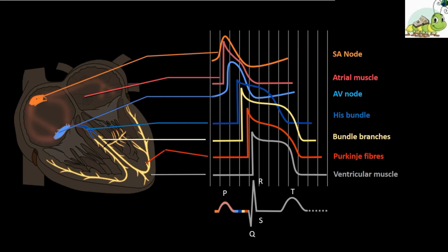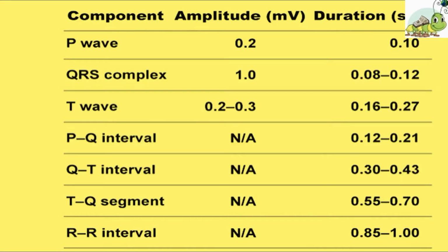Number 3, the T wave, an upward deflection associated with ventricular repolarization in phase 3. It is important to remember that the EKG represents the patterns of action potentials in populations of contractile cells and not that of an individual cell.